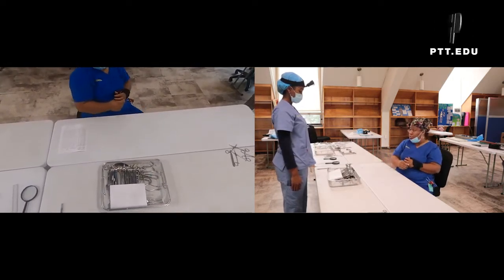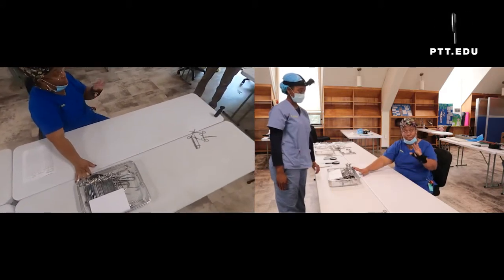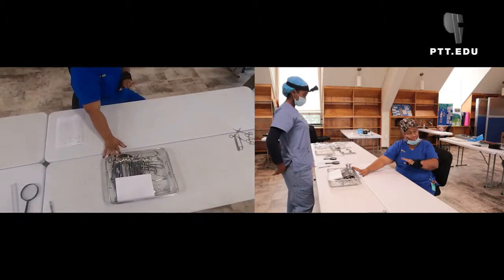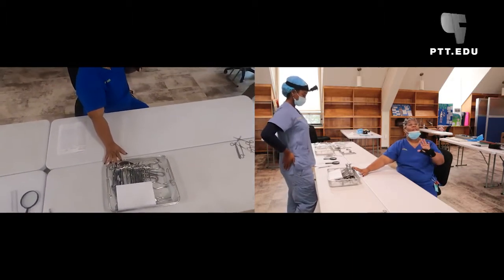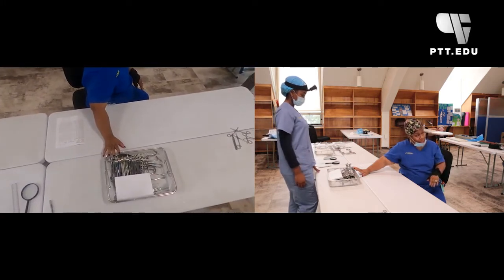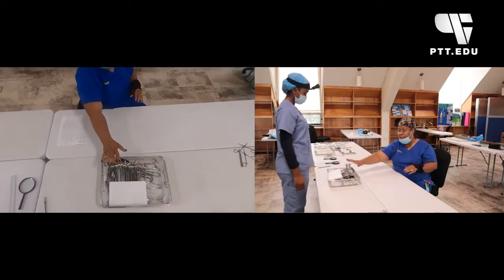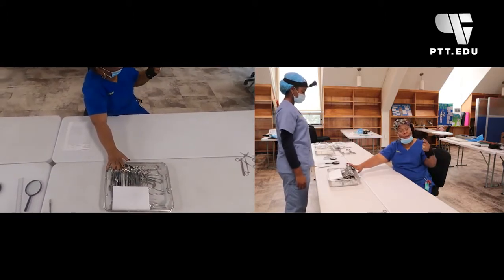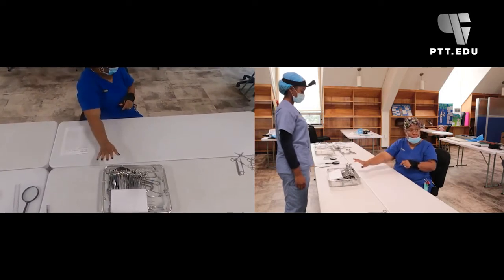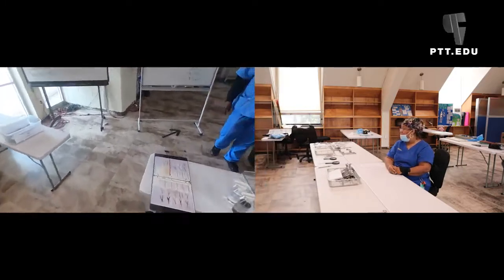Now, another thing that she will do after this is this is supposed to go into a rigid container. However, for simulation purposes for school, and there's also a national shortage of rigid containers in the country, we don't have them. So what we're actually going to do, and what we're actually allowed to do in the field, is to aseptically wrap this particular tray. So do you mind getting a wrap for me, please?